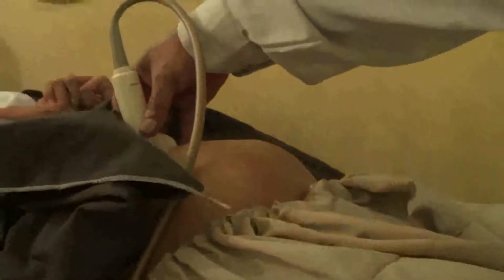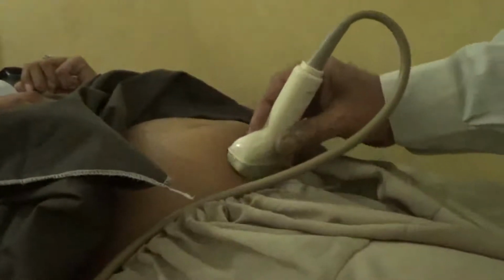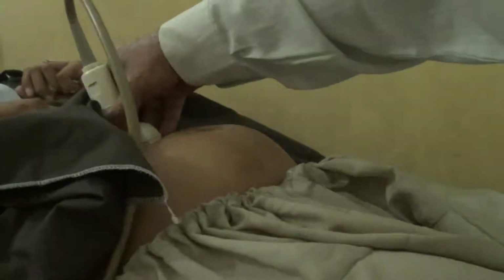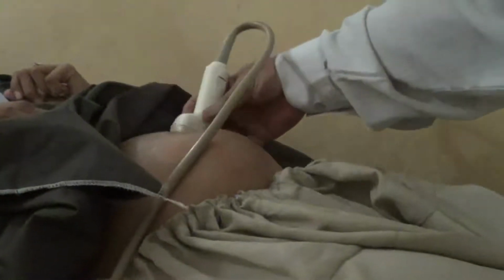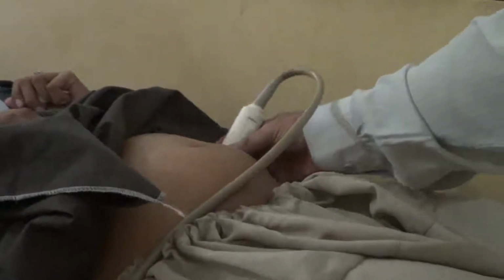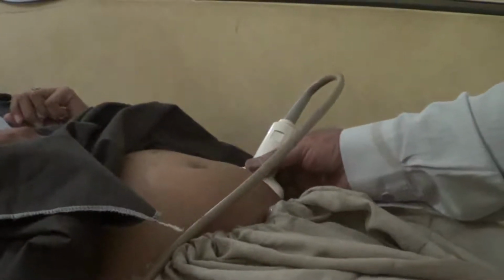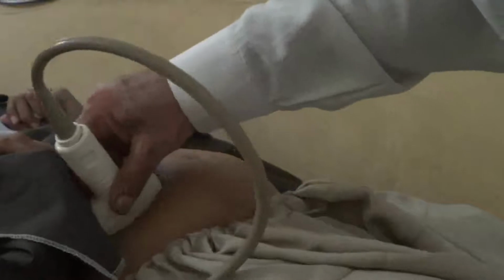So I can see the cyst in this position from the epigastric region, this area, down. Here I see the cyst, here I see the cyst, and here I see the cyst. Longitudinally, I was showing you the cyst is present up to this region. Then when I move the probe towards the left side, it is seen expanding up to the left flank, occupying all of the left side of the abdominal cavity and the right side of the abdominal cavity as well.